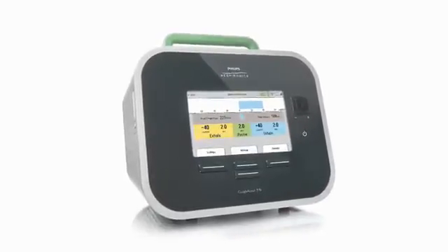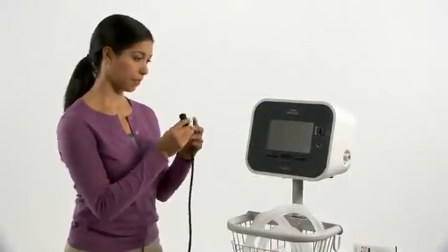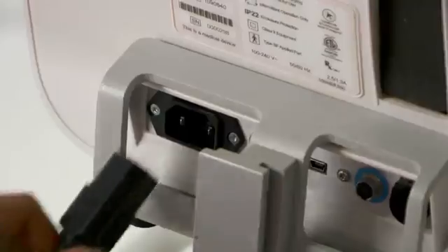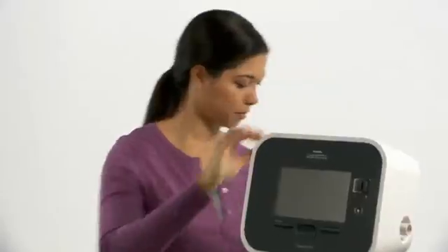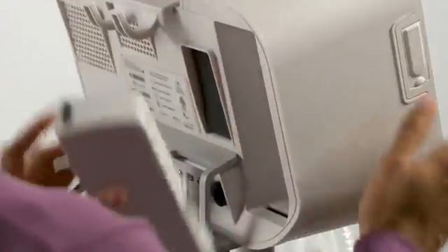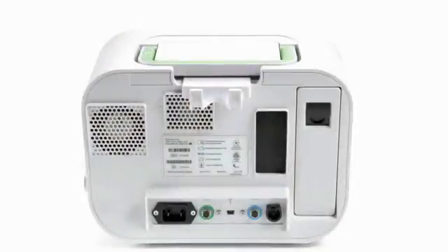CoughAssist T70 is designed to be easy to set up and operate. To power the device, press the power cord firmly into the back of the device and plug the other end into an AC outlet. If you prefer, you can attach the optional lithium-ion battery into the detachable battery slot on the back of the device. A DC power adapter can also be used to connect to an external power source, such as a car battery.